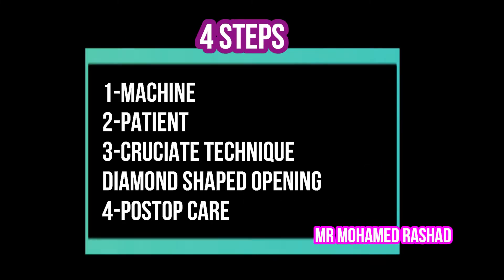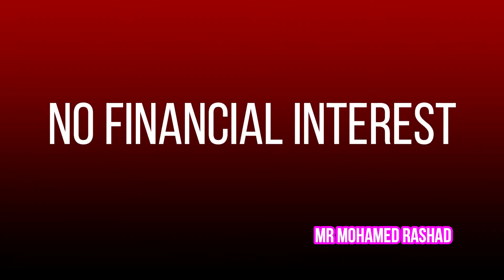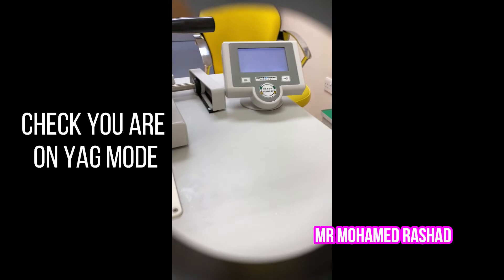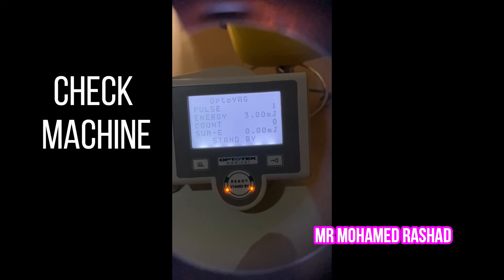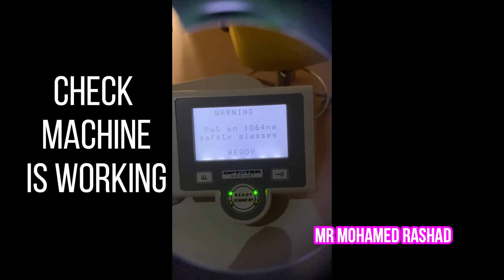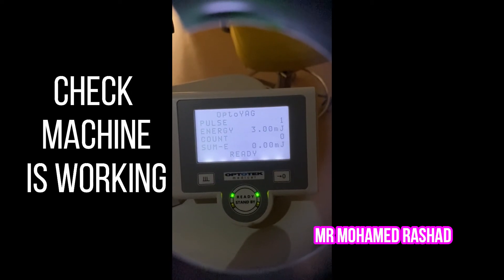There are four steps: you have to know the machine, prepare the patient and the eye, do a cruciate technique, and manage post-operative care. For the machine, the most important thing is to put it on YAG mode, do the settings, and sometimes we need a contact lens. You have to make sure you are not on SLT mode, and that the machine is working well.